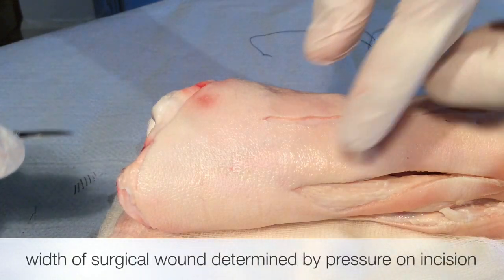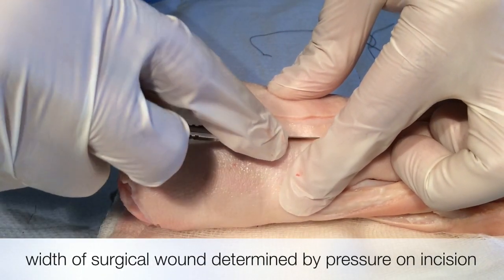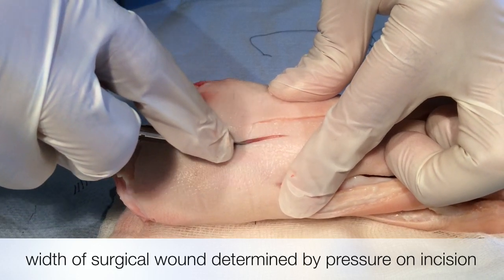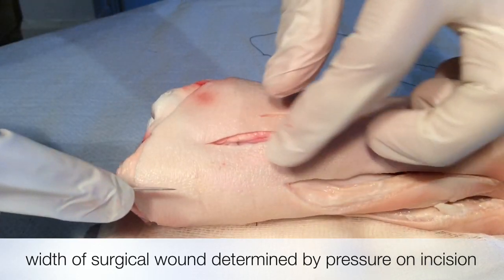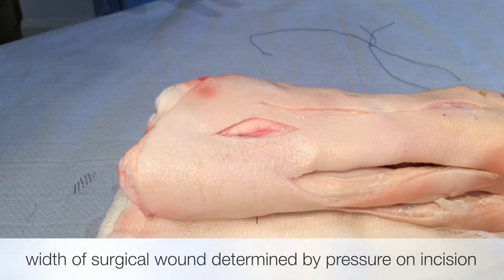The width of the surgical wound is determined by the pressure of the incision. In this clip, I have pressed extremely hard and you can see that I have gone past the dermis, subcutaneous fat, fascia and into muscle. The wound is also wide.